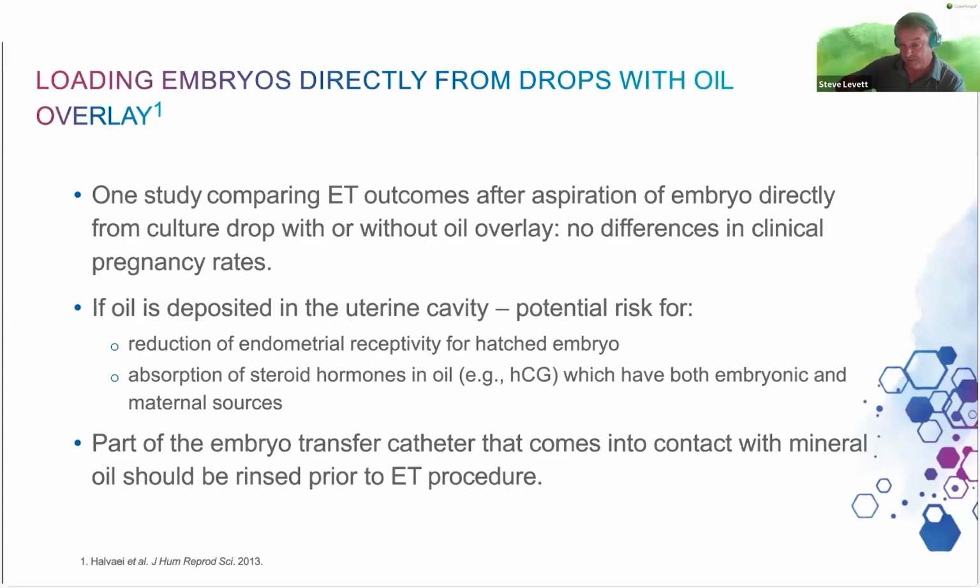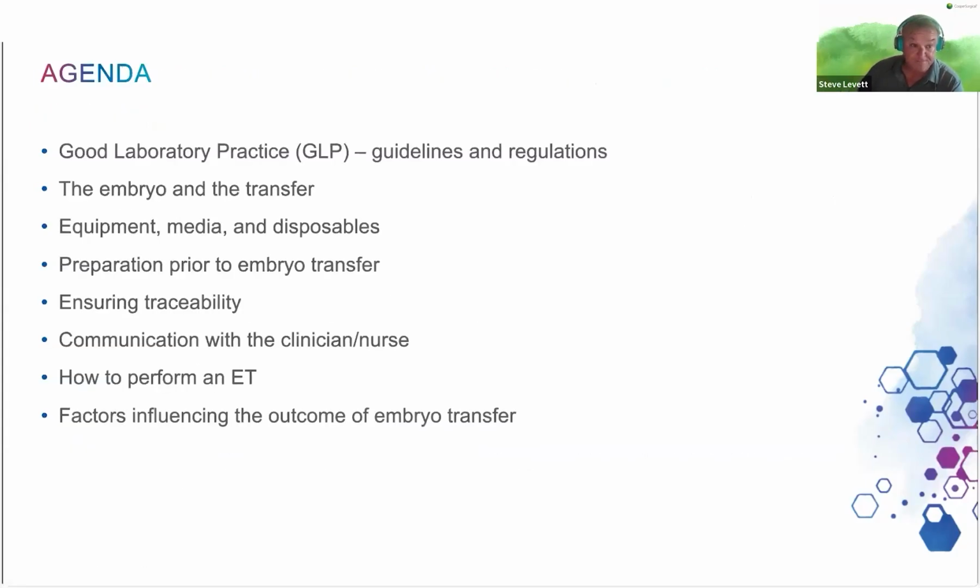So in most cases, if you can get away without using oil, great. But if your conditions are compromised and you're concerned about maintaining an optimal environment, oil can be your friend, and used correctly doesn't have any negative impact in the outcome of the embryo transfer procedure.